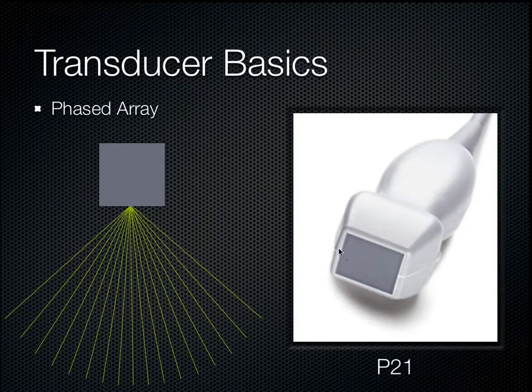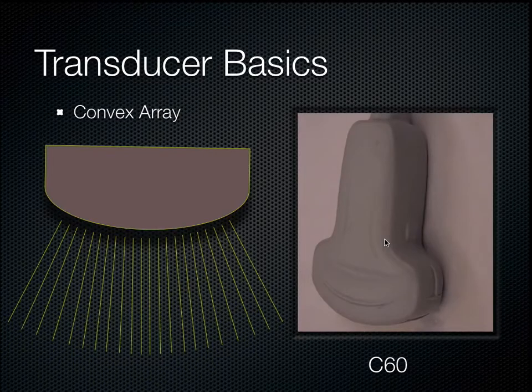And you can actually also see a really good view of the liver and the gallbladder as well when looking between the ribs. So you really need both transducers in your armamentarium to get much better views of the abdomen using this probe. You wouldn't ever want to look at the heart with this probe. It's never designed to do that, though sometimes in a pinch you can get a subcostal view.